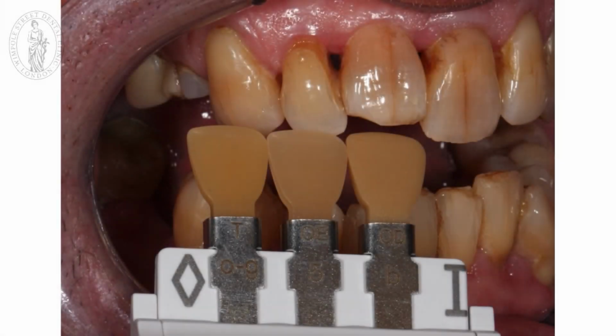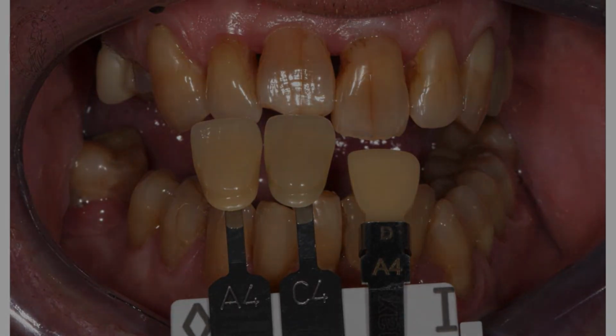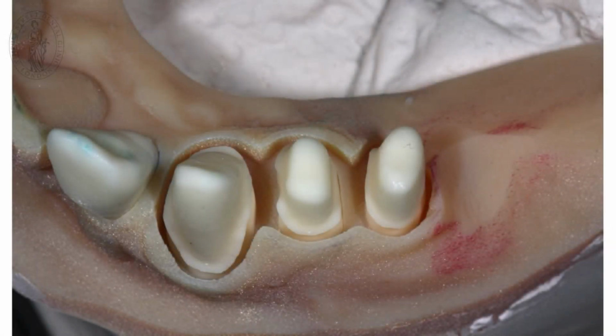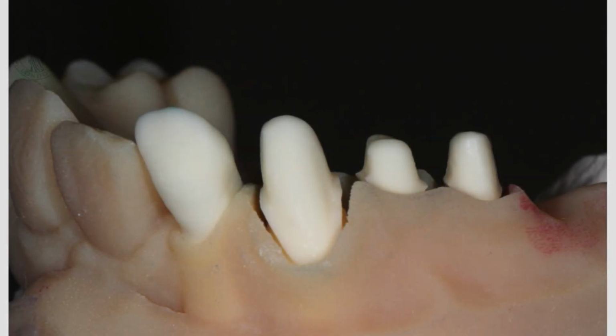So what we do now, we take different colors with different shade guides, using the shade guides used by the laboratory as well, which is matched by the ceramics which they actually use. Take several colors so the technician has perfect work. And you can see here, as I said, it's a rather modern case. We took digital impressions and have a printed model, and then a milled bridge out of a ceramic block.